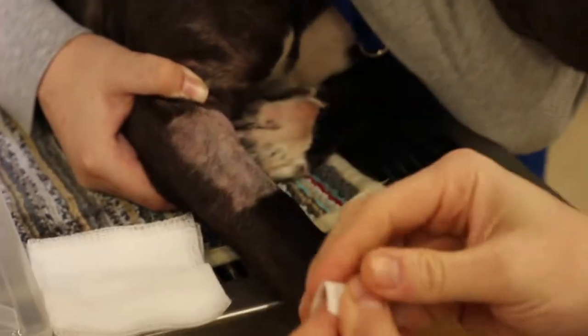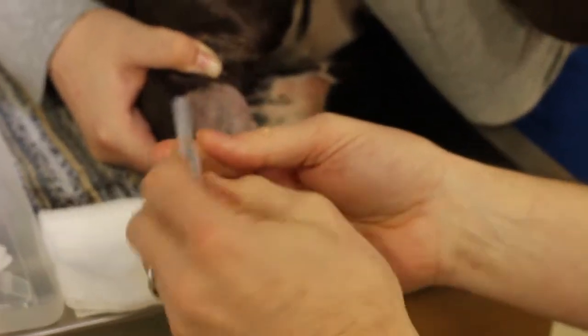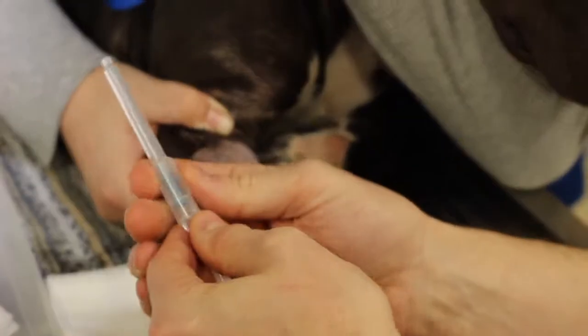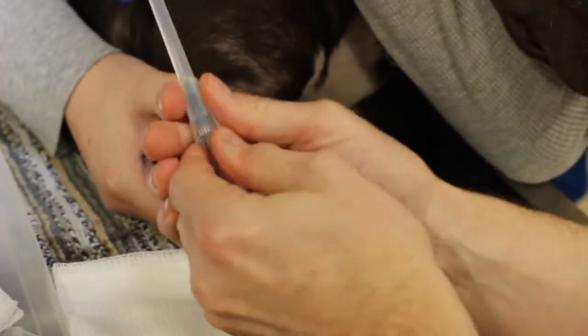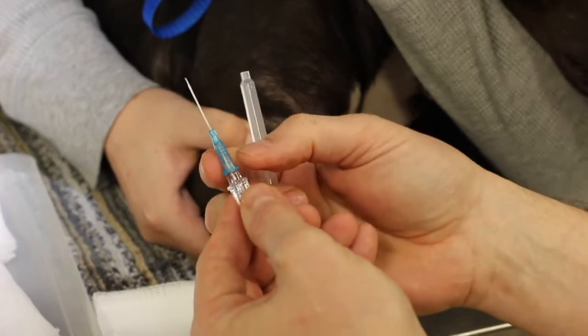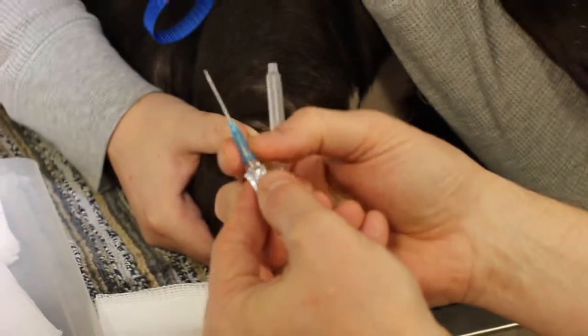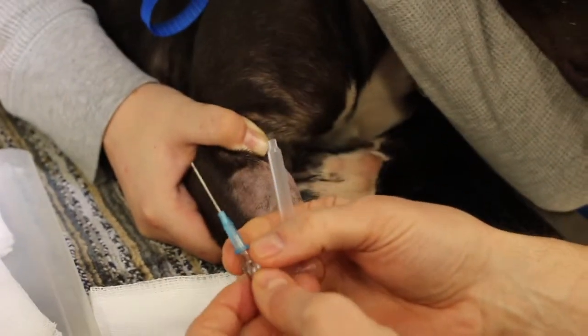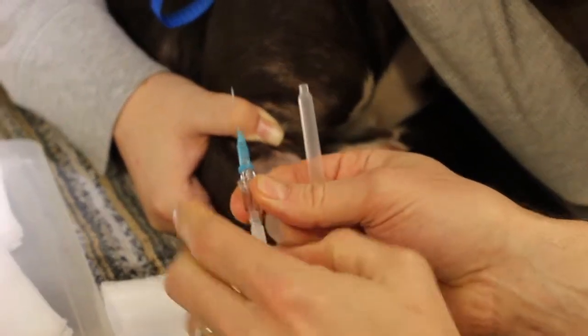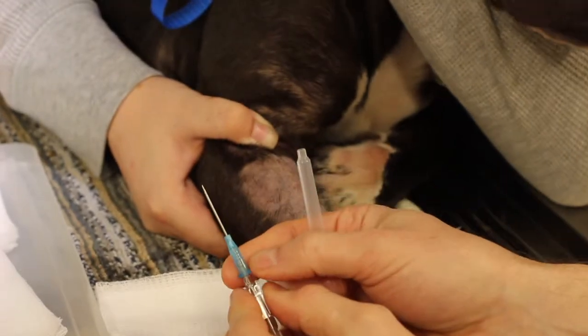The catheter comes like this — unpack it. What we have is it's all covered in a sheath to keep it sterile. So when you open it, before you touch the dog, I like to remove this because sometimes that thing springs out and you lose it. Make sure that the catheter is sitting on here, and then this cap as well. Sometimes it's very tight so I like to loosen that off and make sure it's ready before I get it in the leg.